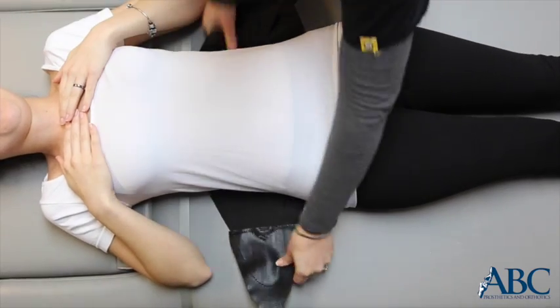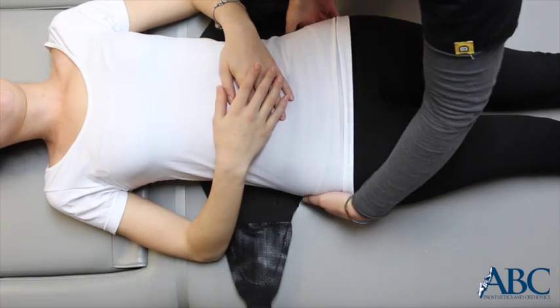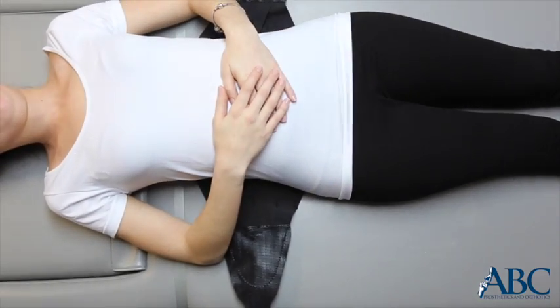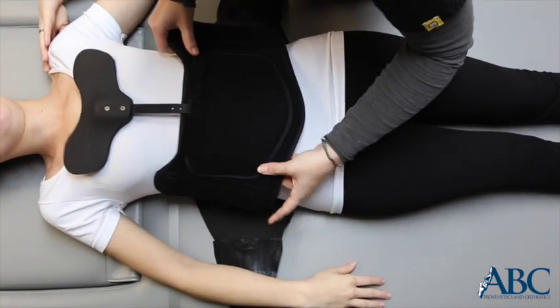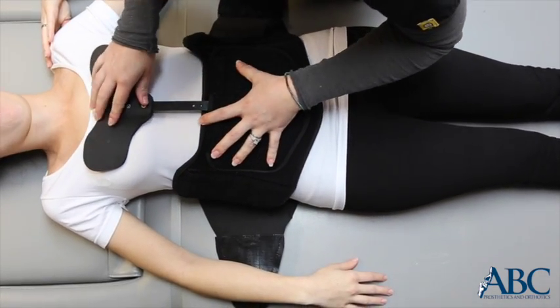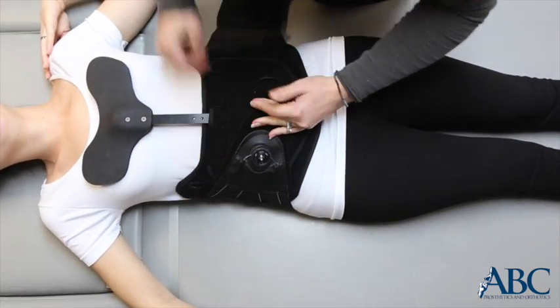Unfold the strap and adjust positioning so the panel is centered on the back and there is even strapping on both sides. Place the anterior or front panel low on the abdomen so that the bottom is even with the pubic bone. The thoracic bar, or chest bar, should be low on the chest.